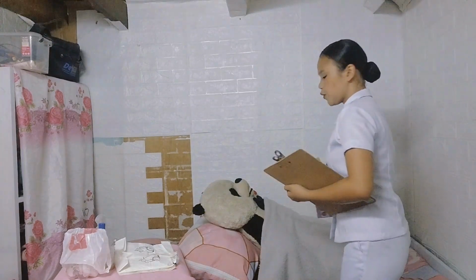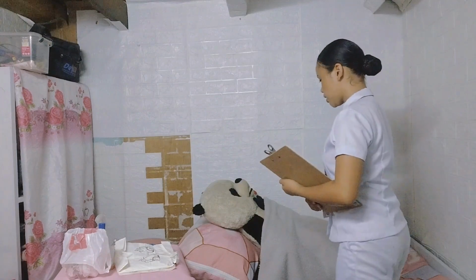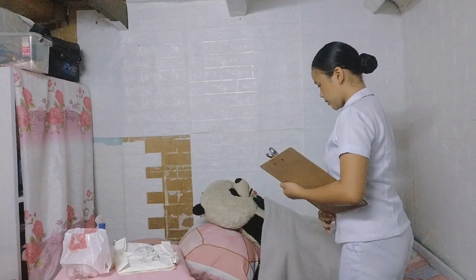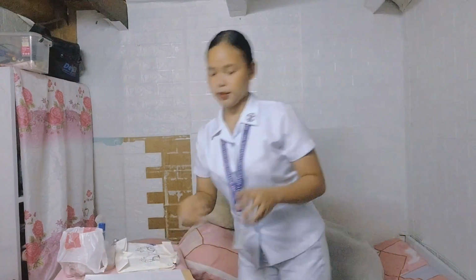Okay. Before we start, sir, is it okay if I close the door so that no one from the outside will disturb us while we're doing the procedure? Okay. And now assist the client into a chosen position, depending on the chosen site. Appropriate positioning can give relaxation to the target muscle.